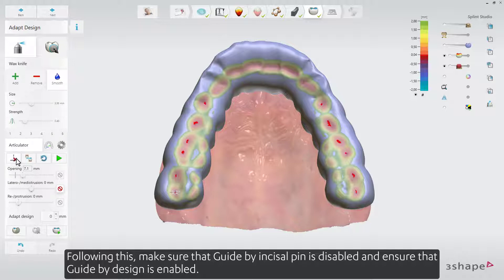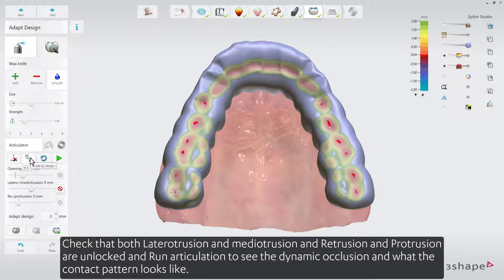You can enable Lateral-Otrusion to see the dynamic occlusion and what the contact patterns look like. Lateral-Otrusion and Medi-Otrusion contacts are shown in green and blue.